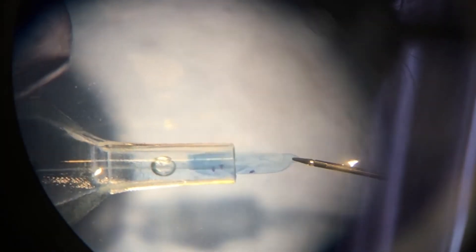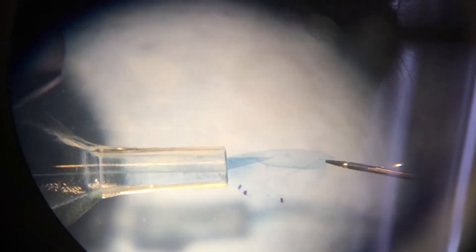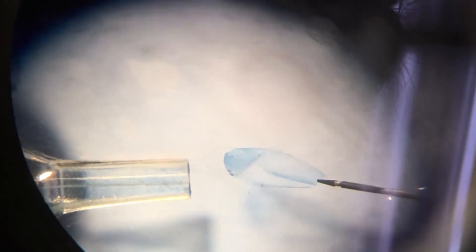Our device has been rigorously tested. Shown is a real tri-folded, pre-loaded DMEC graft being pulled out of our inserter into conditions that simulate the inside of the eye. As you can see, the graft naturally unrolls.